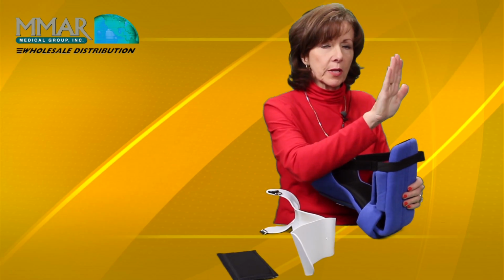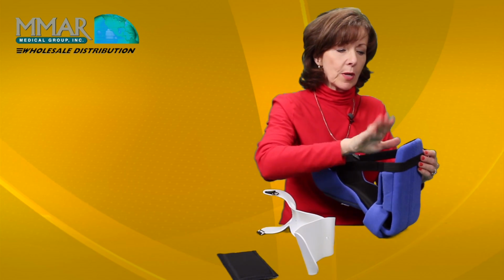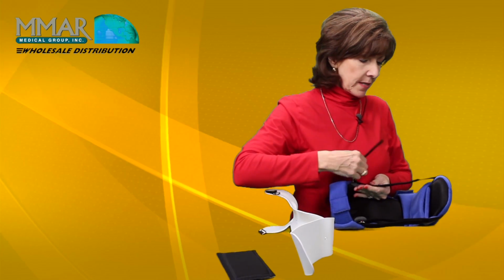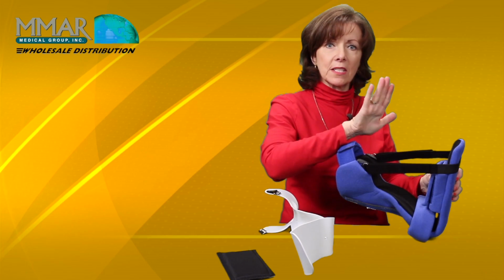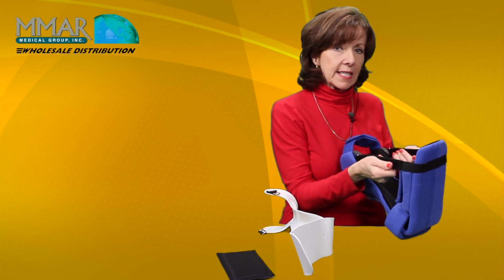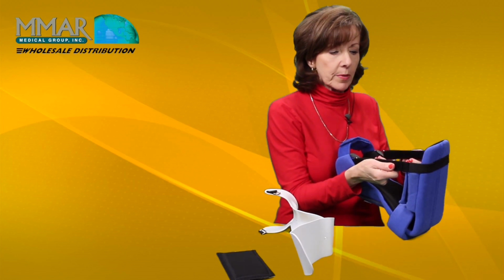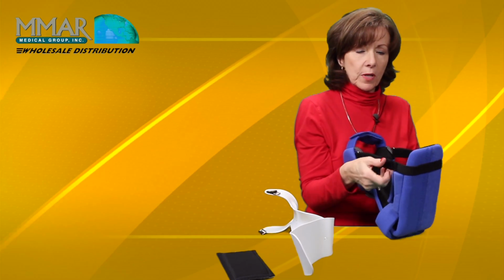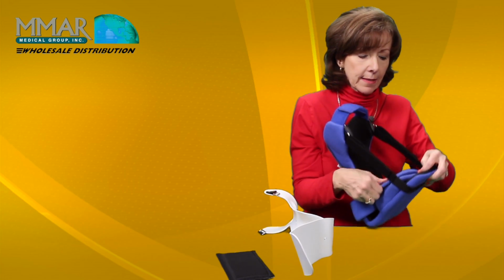If the foot is going a little bit in one direction versus the other, let's say they're going out, I'm going to make this side a little more snug than this one, just to give that a little tug. All you're doing is a tug toward normal alignment, and again, reducing the tone. Once these are set, only the fitter or a therapist should be changing the angle. If your foot is just down, you want these symmetrical where they're tugging up at the same length.